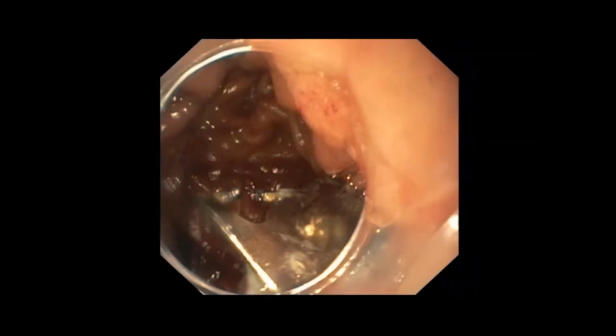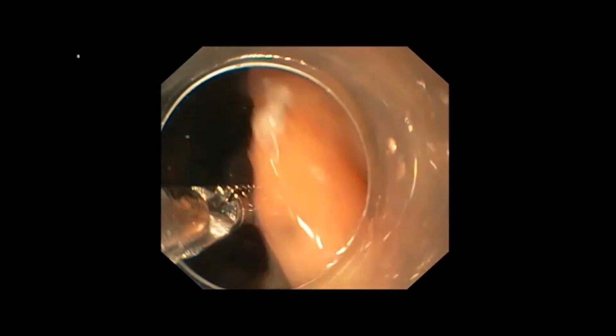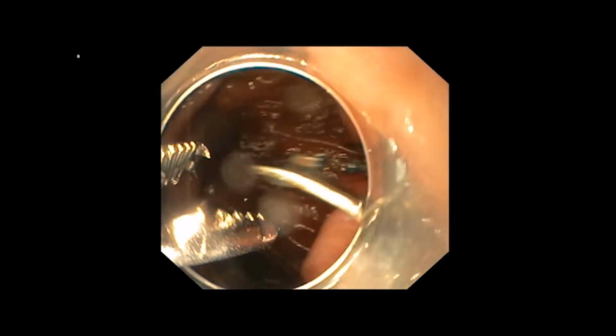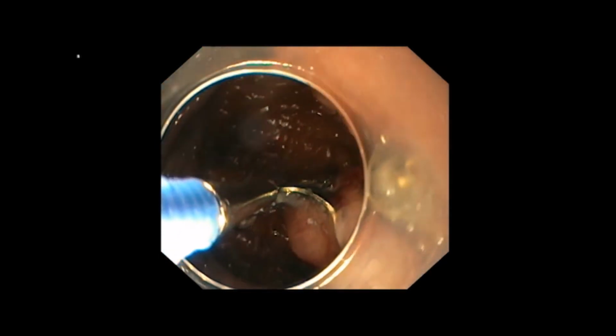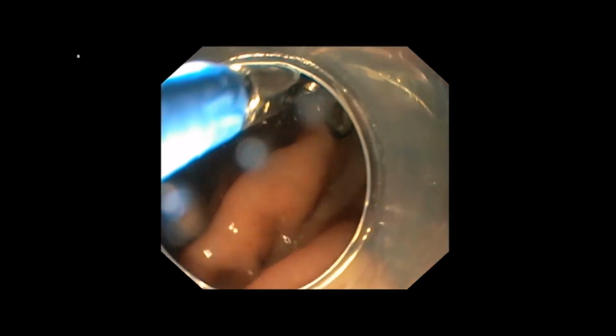Following successful fragmentation of the clip, the supplied remove secure cap is attached to the distal end of the endoscope. The clip fragments are drawn into the cap using the remove grasper and are extracted from the digestive tract.